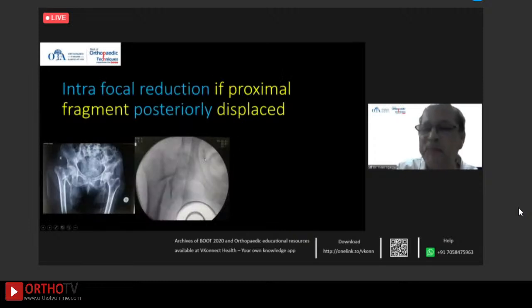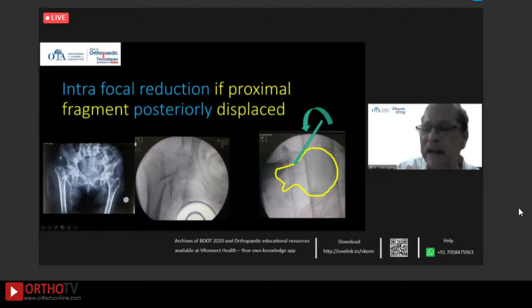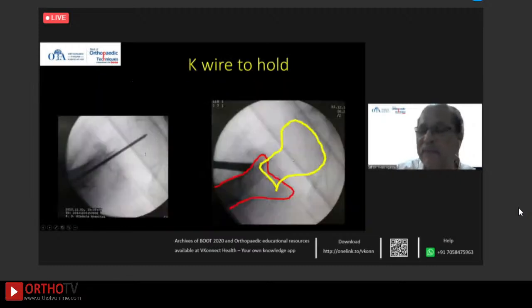And if there is a posterior displacement, as you can see here, one does an intrafocal reduction. So I put a spike inside the fracture site and levered the posterior fragment out, and then held it with a K-wire.